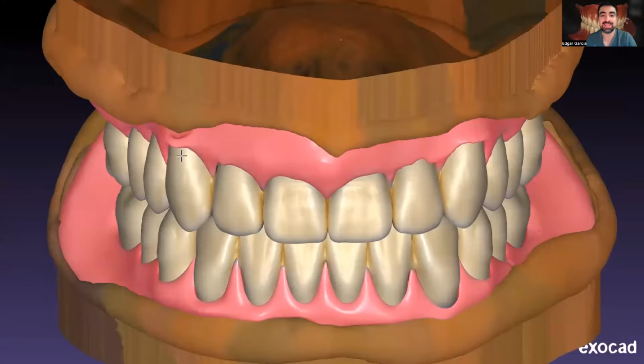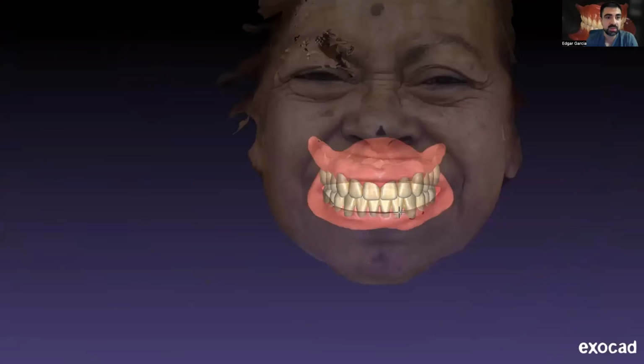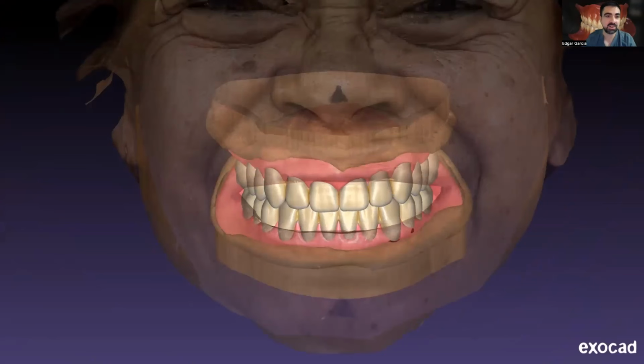Why the easier protocol? Because this protocol that I'm showing, even a student can do it because it's super easy. Right. You don't need an intraoral scanner to do this protocol. You don't need one, okay?